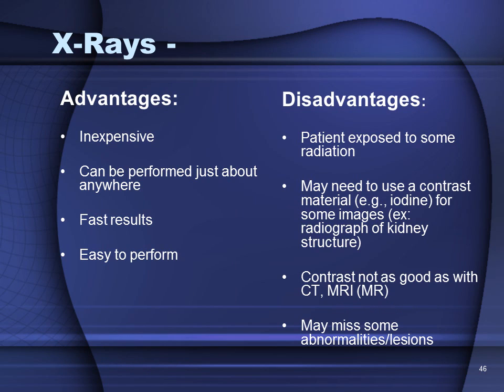Like any method, there are advantages and disadvantages, and with respect to the X-rays, the advantages are that they are relatively inexpensive. They can be performed pretty much just about everywhere, and the results are fast and they are easy to perform. The disadvantage, the main disadvantage, is that the patient is being exposed to some radiation.